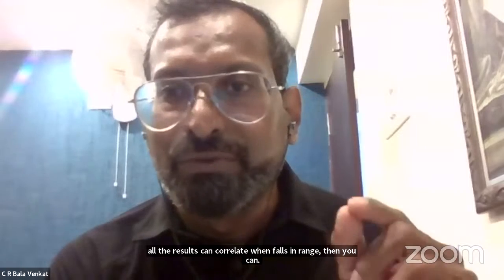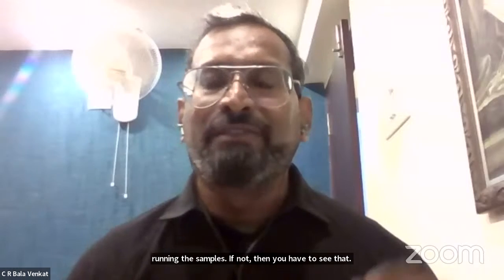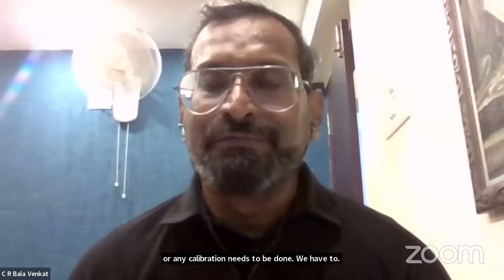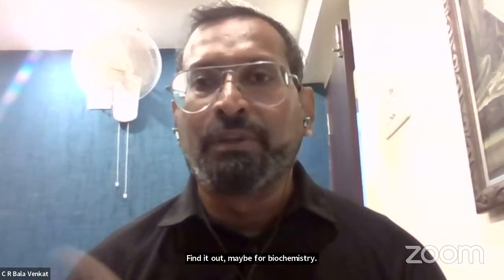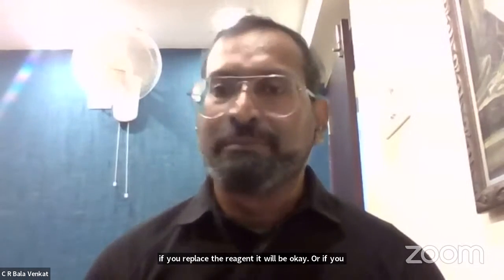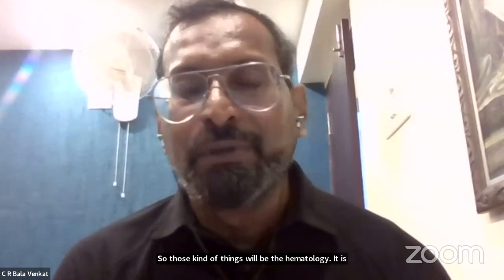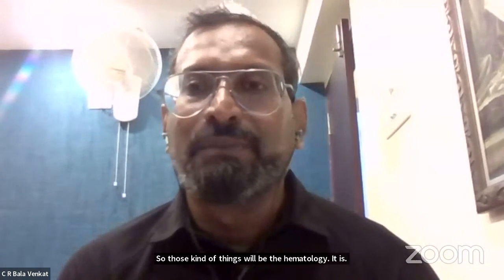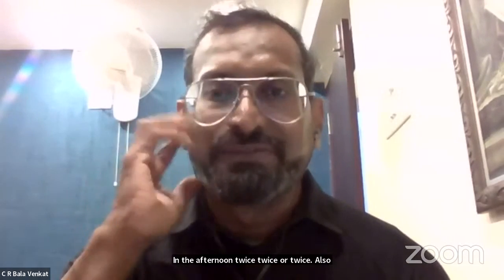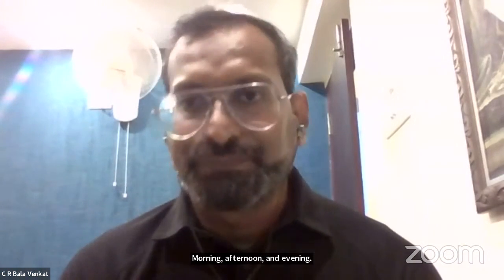If not, then you have to see where we are going wrong, whether any cleaning or any calibration needs to be done. We have to find it out. For biochemistry, we have this kind of problem for a few parameters. Maybe if you replace the reagent, or do the calibration, it might be okay. For hematology, it is mandatory, and even in hematology, if the sample workload is more than 100, we can run the controls twice or thrice: morning, afternoon, and evening, if you are running 24 hours.